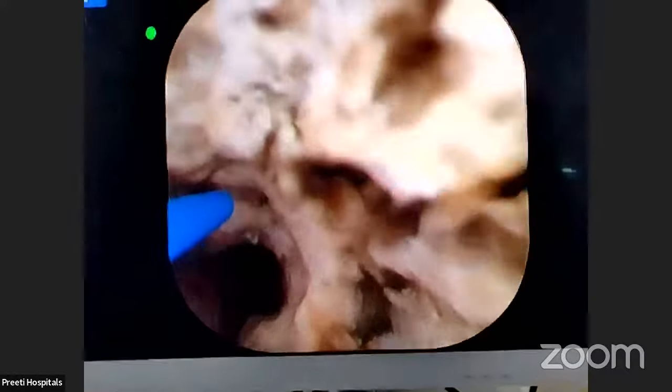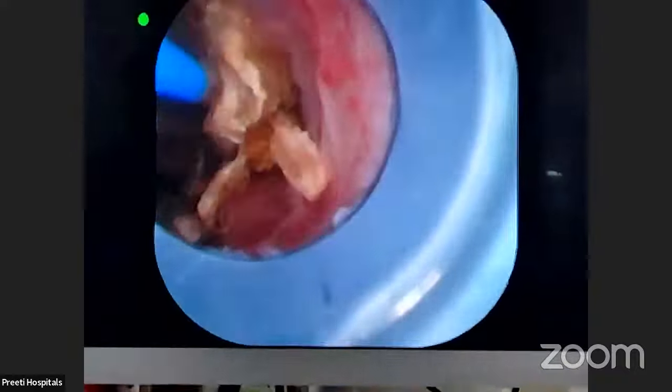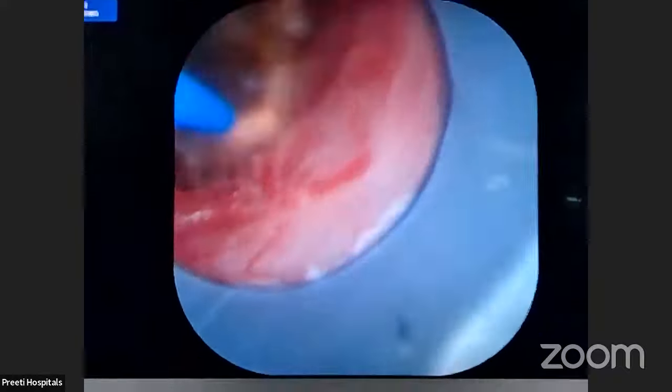See, I struggled for 5 minutes passing the access sheath because it is tight. Even after the stent, we usually use 3.5. Maybe we have to use it, even though people say it is the same. See, exactly, I am in the access sheath, the mouth is there. Like this. Any question? Yes, sir.